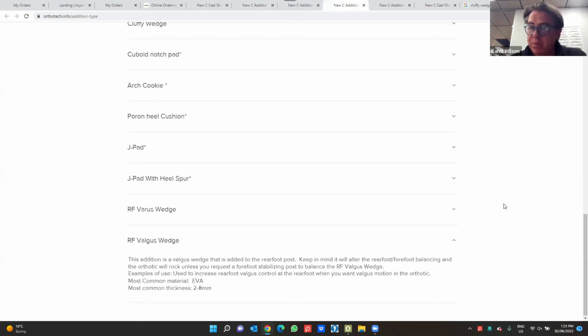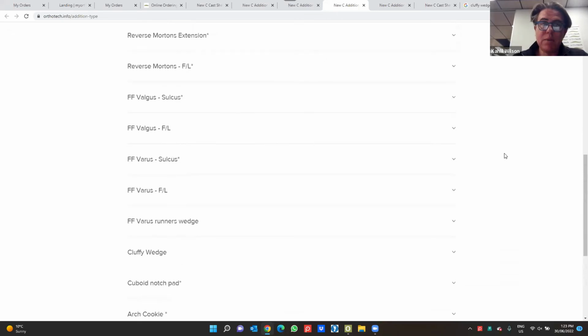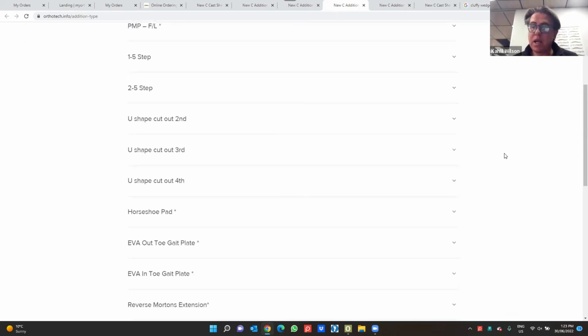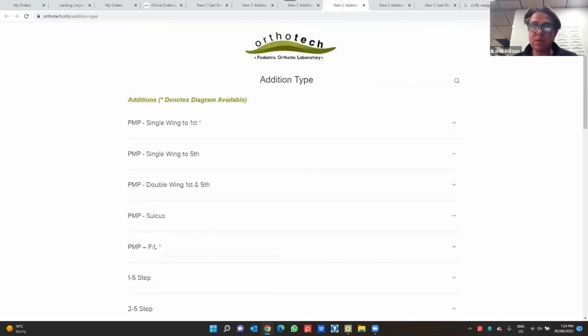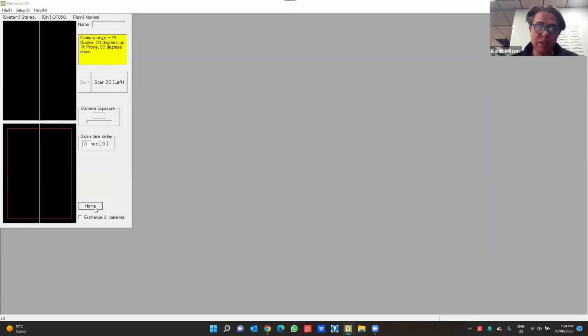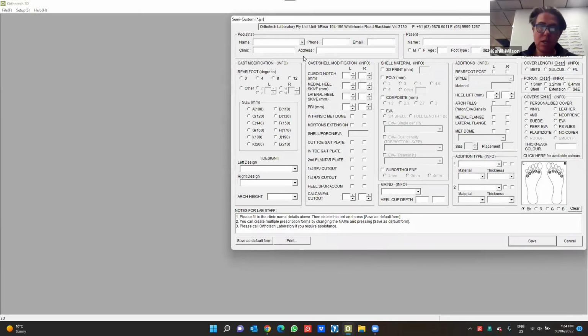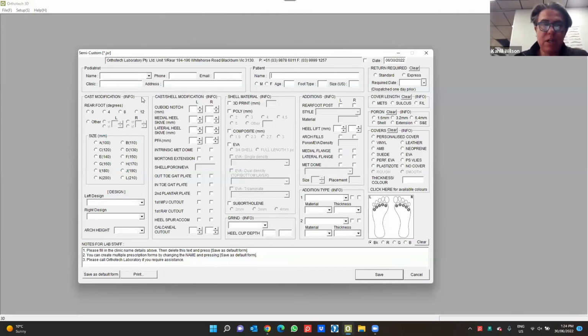Okay, so we're coming up to 55 minutes. I'm mindful that many of you are doing this in your lunch break and have got patients to get back to. So if you've got a couple more minutes, let me just jump into another change in relation to our semi-custom orthotic. This has been a massive change. We used to have 4 designs and 4 rear foot, so 0, 4, 8 and 12 degree. We then added all our designs, but some of them had to be 3D printed.